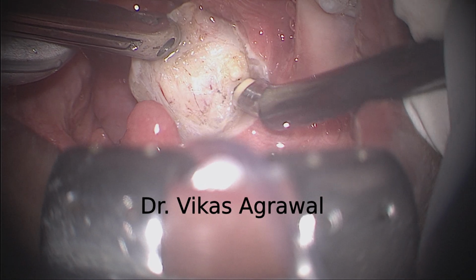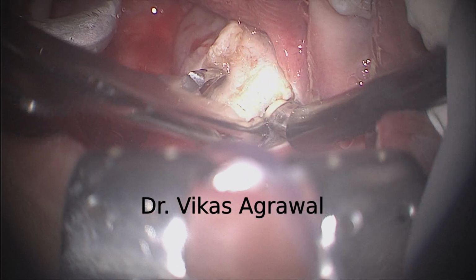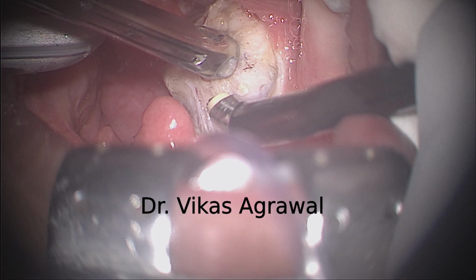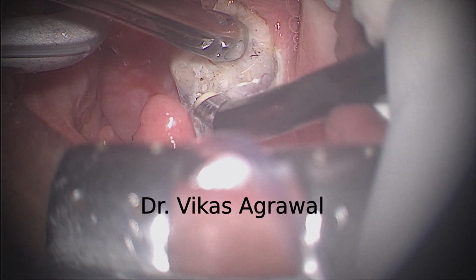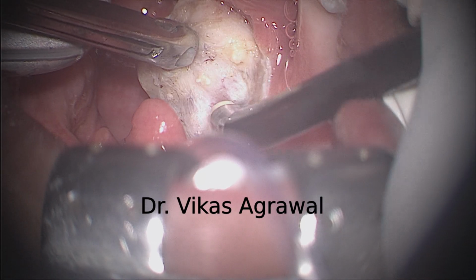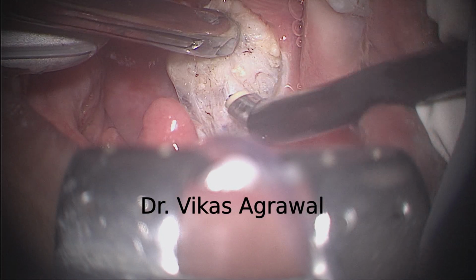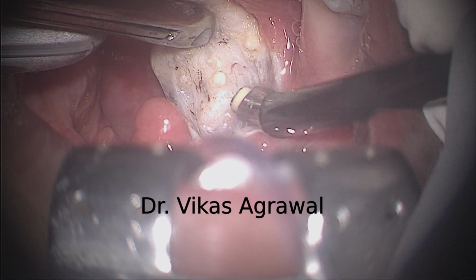All right. See, this is the tonsil tissue, and you'll get the muscles on the other side. So I have to remain between the muscles and the lymphoid tissue. These are the connective tissues which I am dividing. Can you see this? There is no exposure of the muscles so far. If I remain in this plane and do not expose the muscles, then only the surgery will be painless and bloodless.